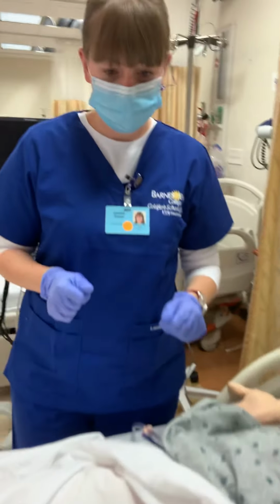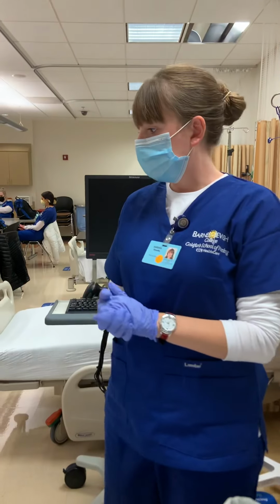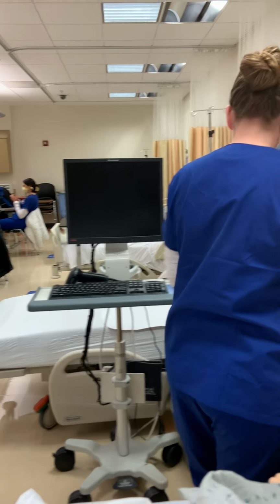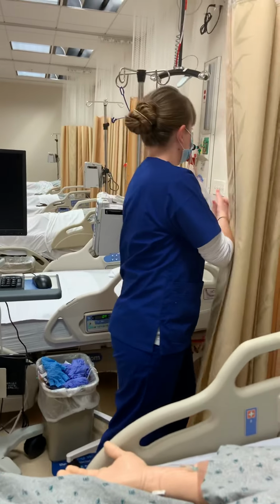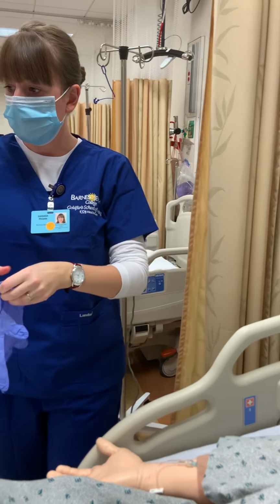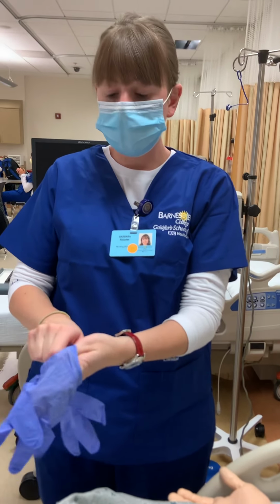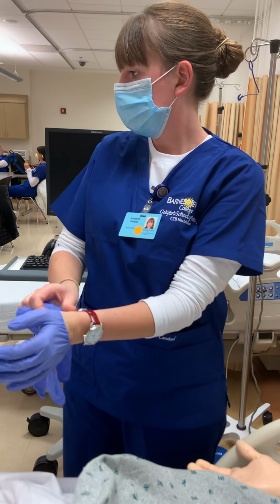All right. So at this point, then I will be changing these gloves out. Hygiene. Each time that I would have left the room for a new procedure, I would have cleaned up the bedside table and wiped that off. So I'm going to do that right now.